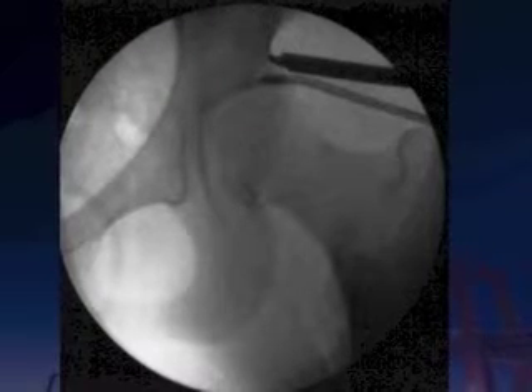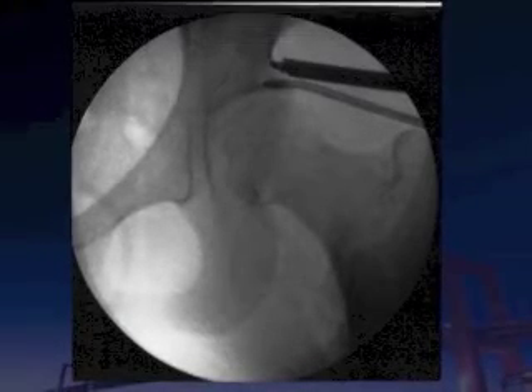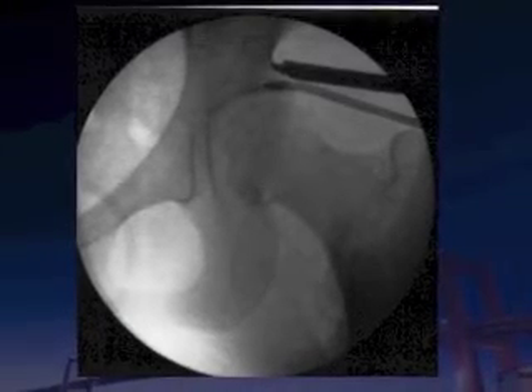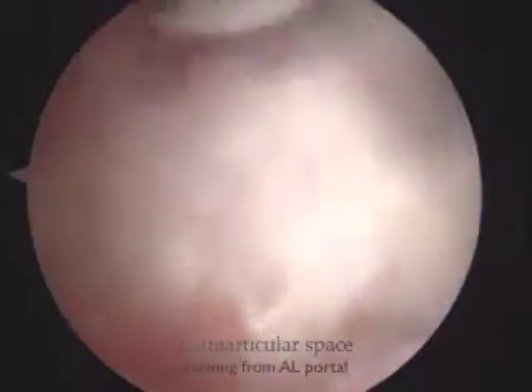To perform the endoscopic shelf acetabuloplasty technique, we place the arthroscope into the extracapsular space under fluoroscopy imaging. We identify the reflected head of the rectus femoris along with the anterior acetabular rim and divide it.